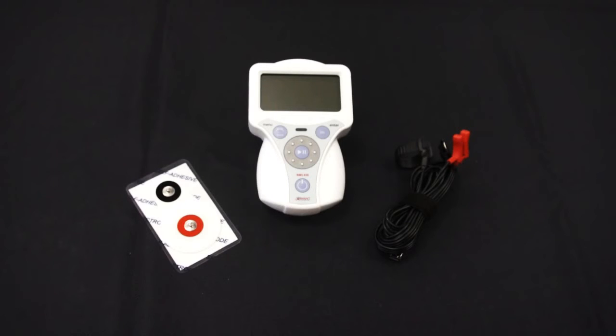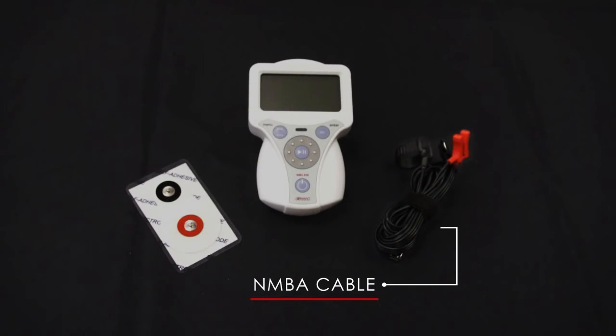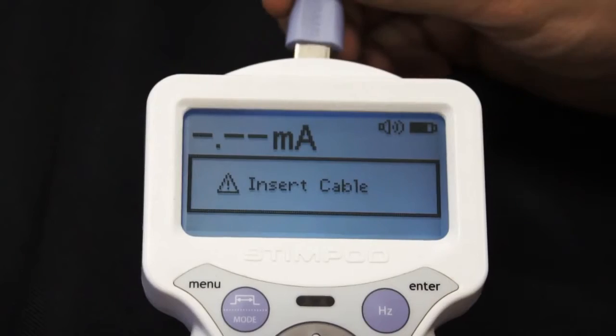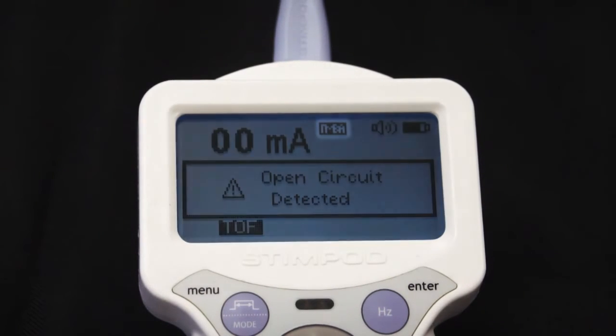For this demonstration you will need the NMS 450, an NMBA electrode or standard ECG electrode, and the NMBA cable. Step 1: Switch the Stimpod device on. A warning screen will appear prompting you to insert the cable. Step 2: Insert the cable. The accelerometer light will flicker from red to blue, and a screen alert stating 'open circuit' as well as the NMBA mode icon will appear, and the device will default to TOF mode.